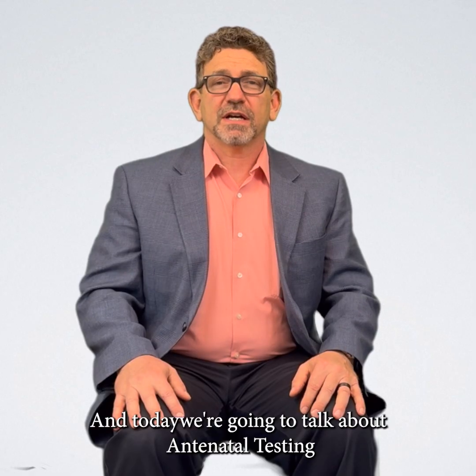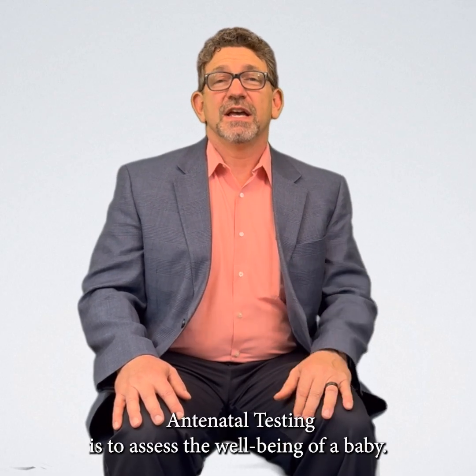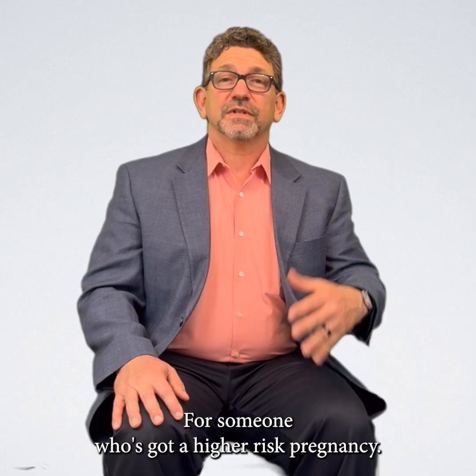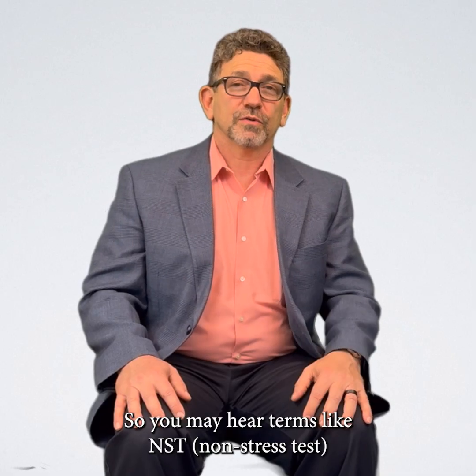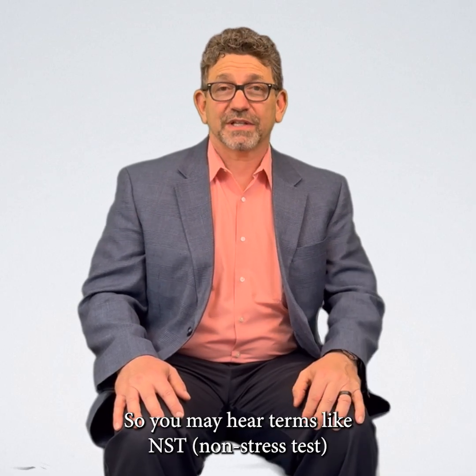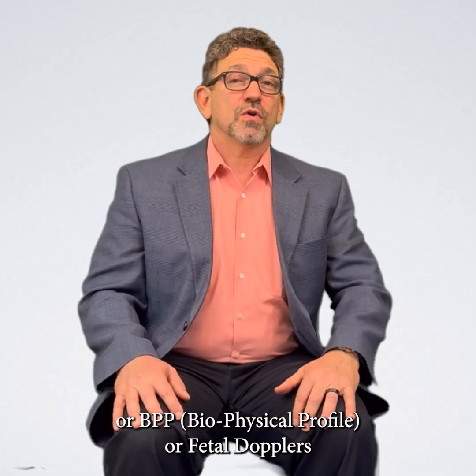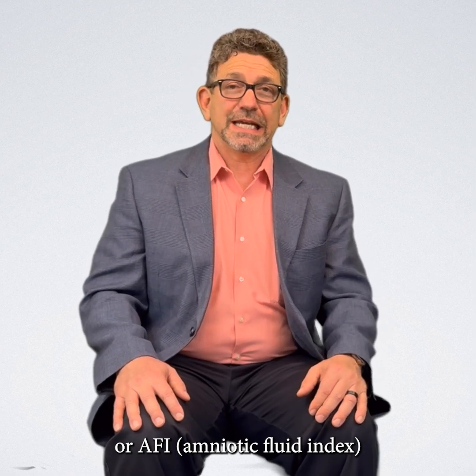And today we're going to talk about antenatal testing. Antenatal testing is to assess the well-being of the baby for someone who's got a higher risk pregnancy. So you may hear terms like NST, non-stress test, or CST, contraction stress test, or BPP, biophysical profile, or fetal Dopplers, or AFI, amniotic fluid index.